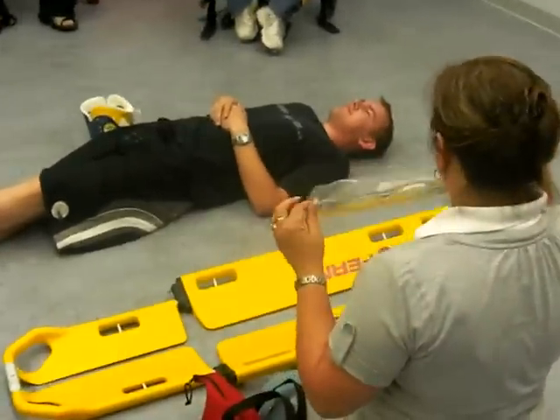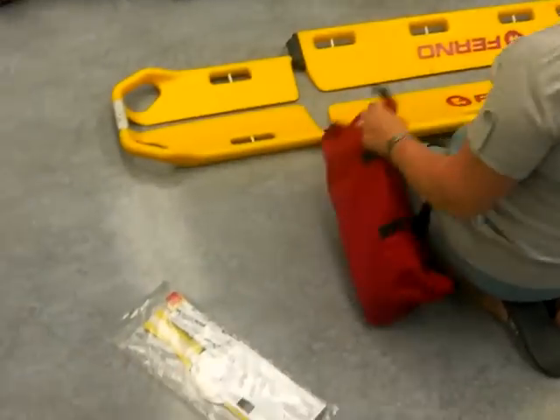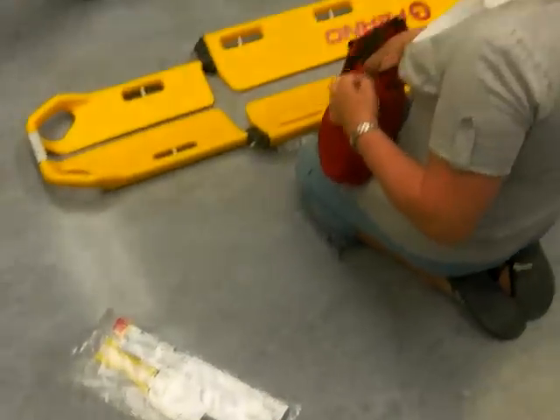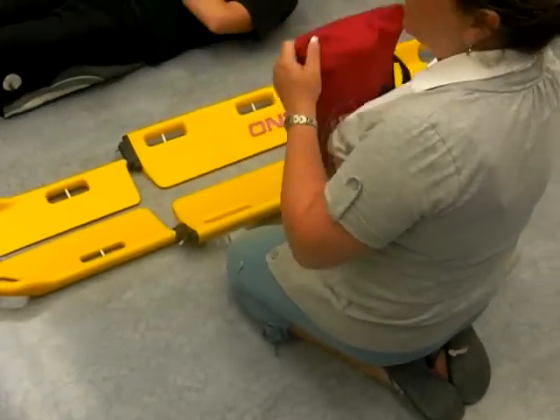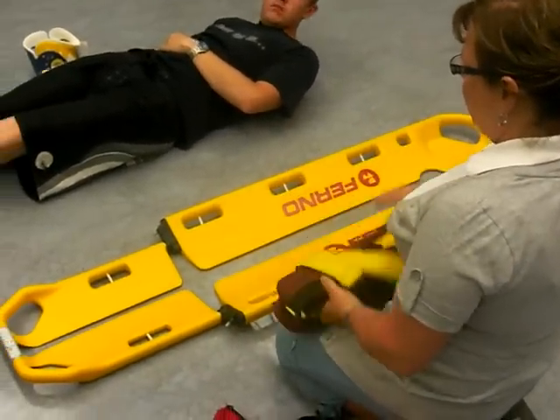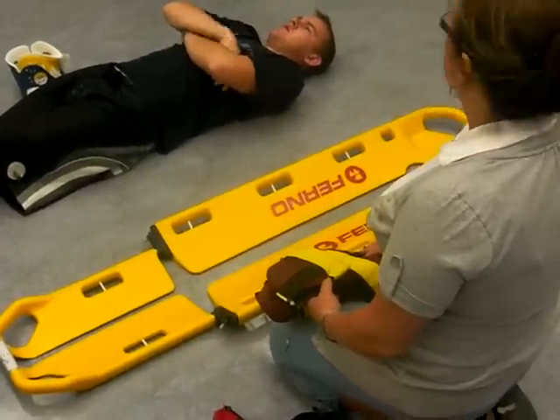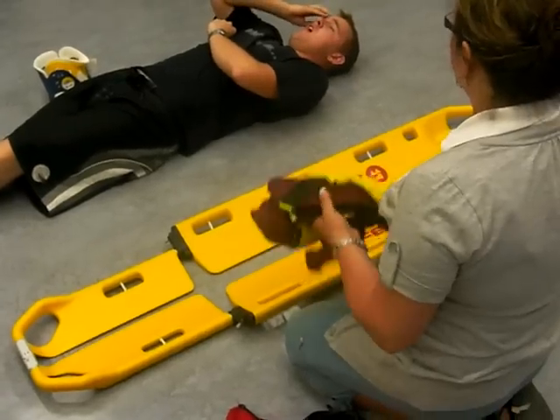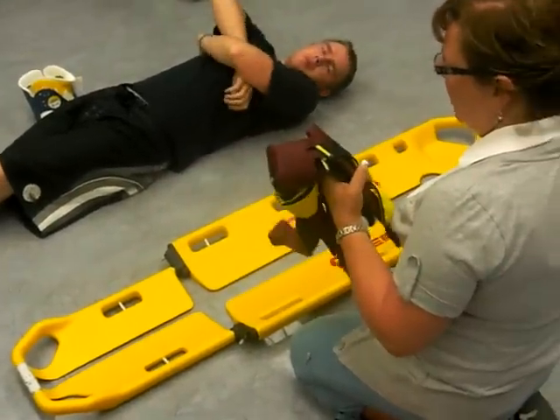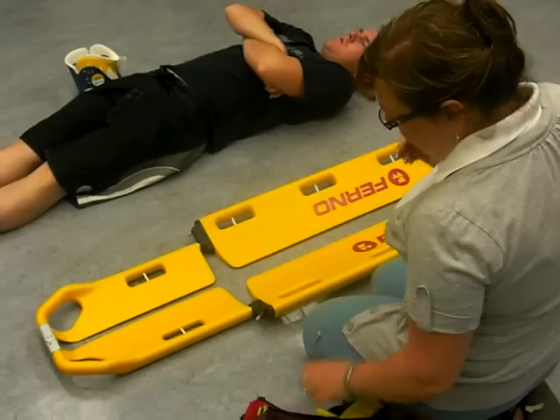These are spider straps. They're one-time use only, but they do secure the head. They work well, however they have limitations. A really big guy, this doesn't work so good on. If you're going to do a lateral package, it doesn't work on. So they do have their limitations. Yes, they're fast. If they're put away properly, great. If they're not, they're just a big mess. So these are your spider straps.